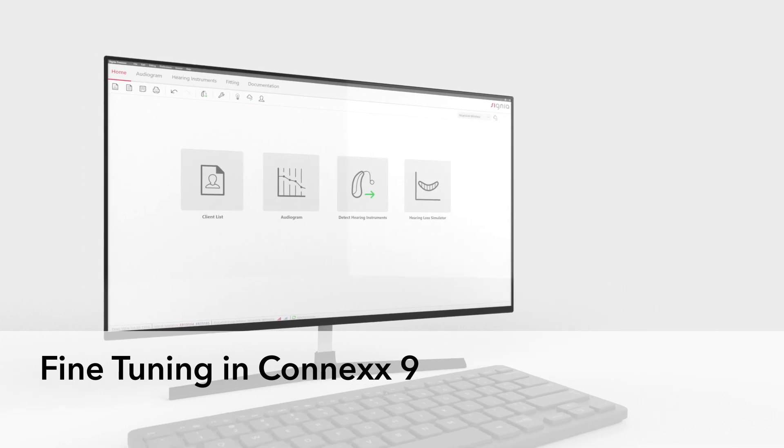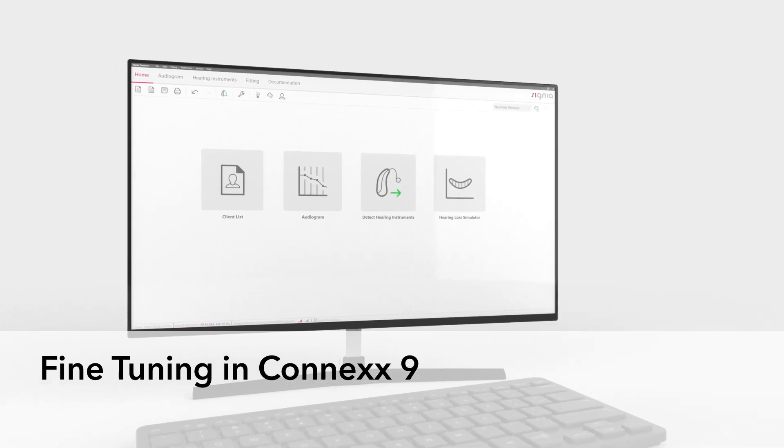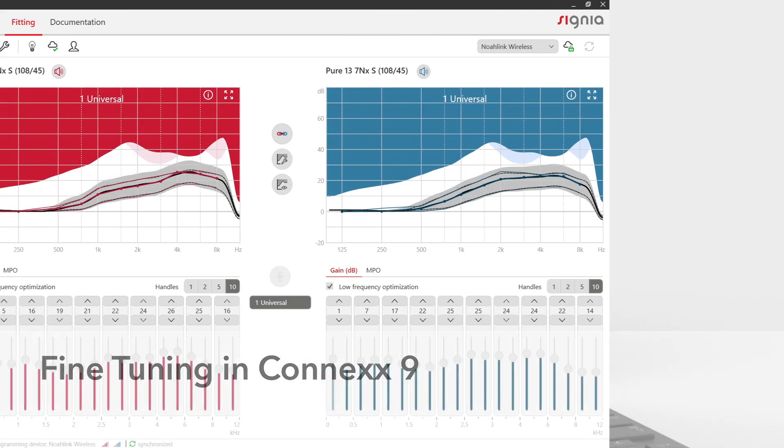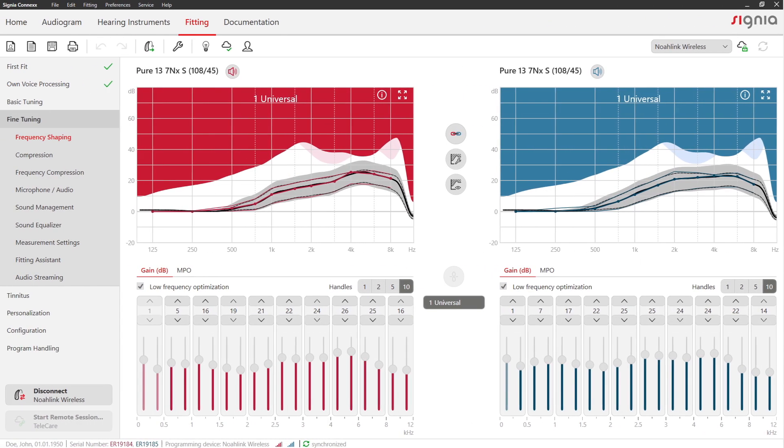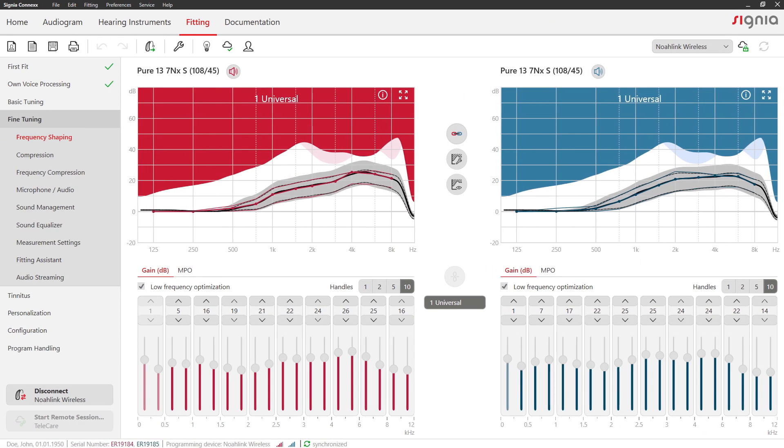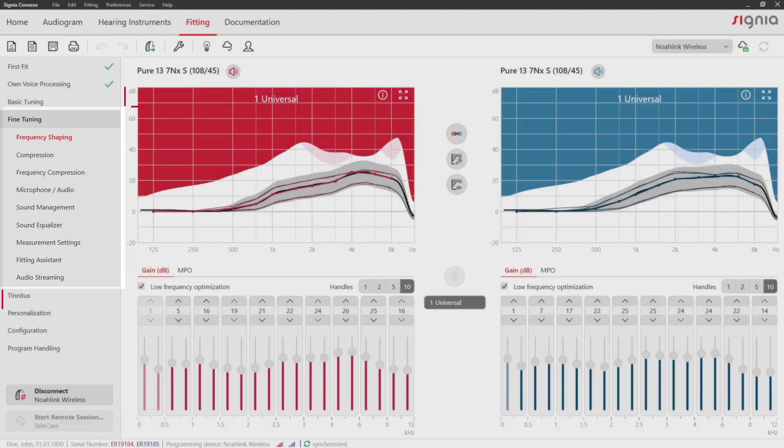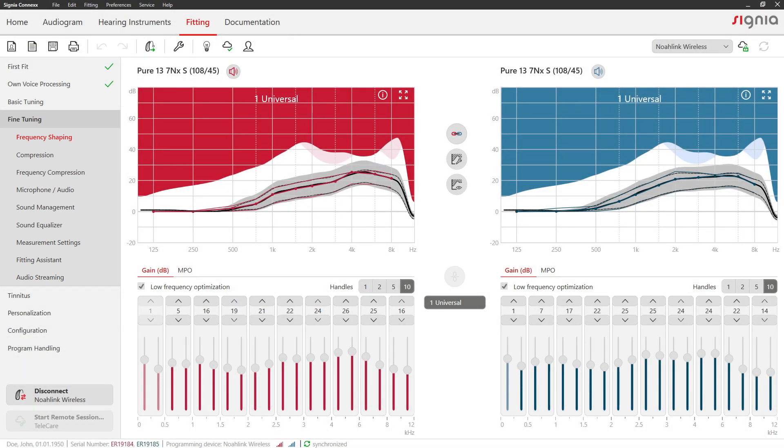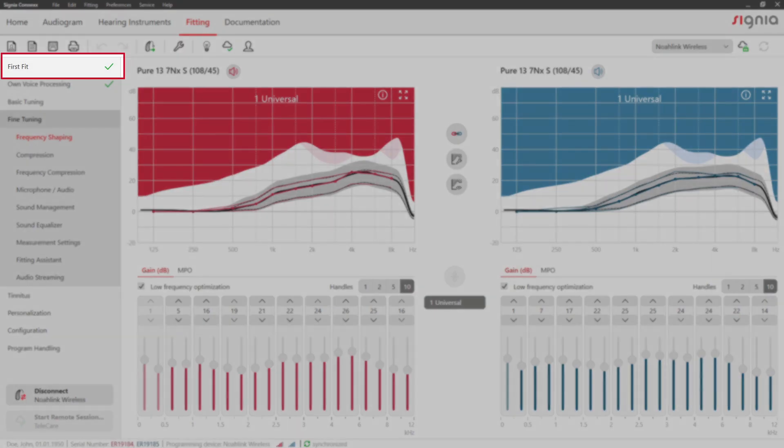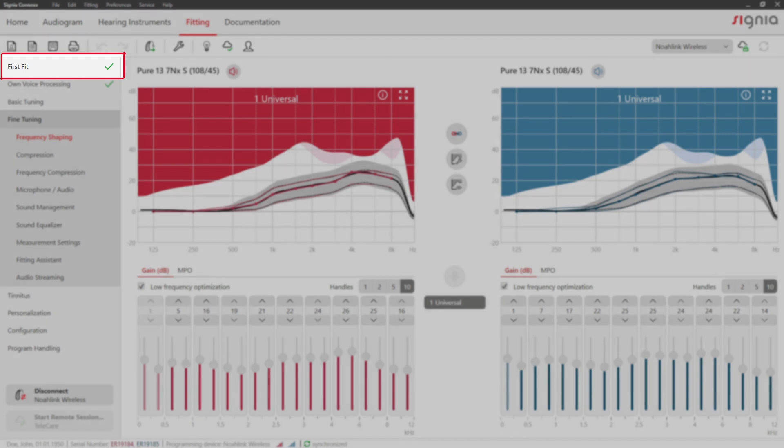Fine-Tuning in Connex 9. Within the Fine-Tuning section, you have many options to customize the settings to your client's needs. A first fit should have been performed before you proceed with fine-tuning.